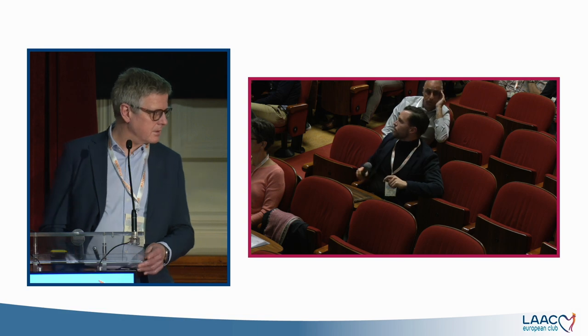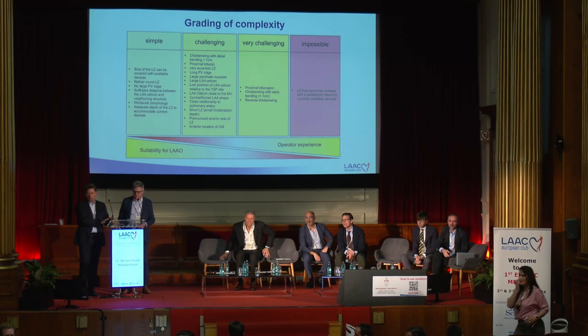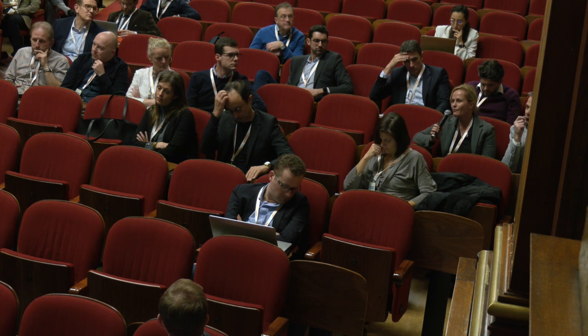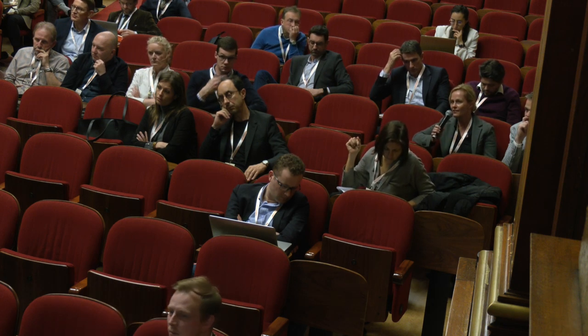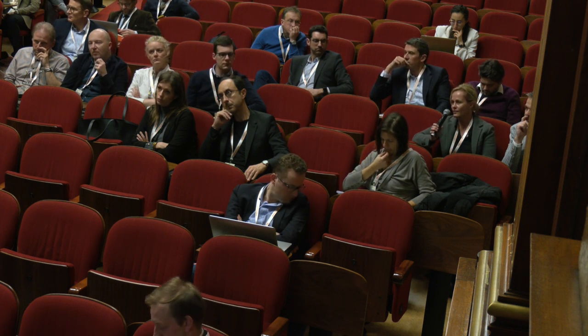We are using something similar for TEER procedures, and it's very well accepted because it gives you an indication: this is a case I could start with. If I'm a center starting with the first cases, I don't want to start with the most complex things. Another important point is that it makes a lot of sense to look at the morphology of the left atrial appendage before the procedure. This should really be in the focus, that we have a plan and a strategy before we go into the procedure.